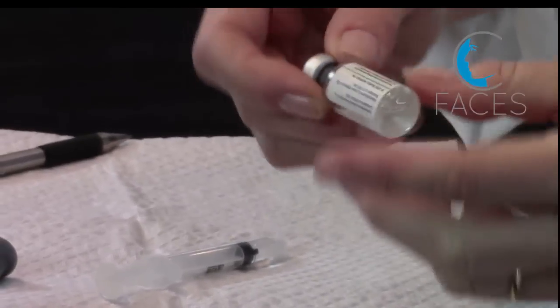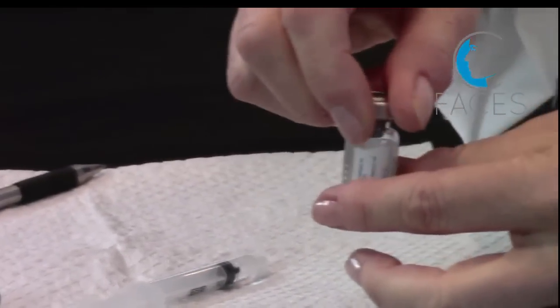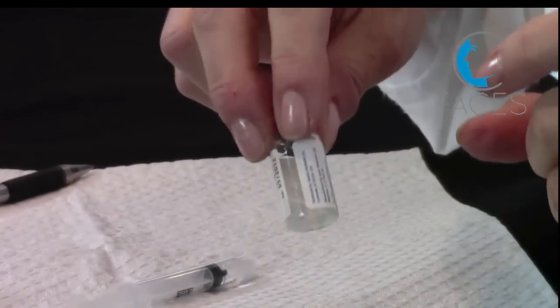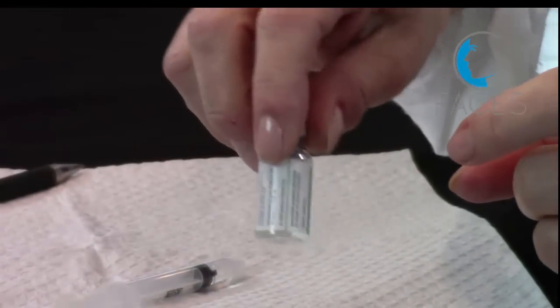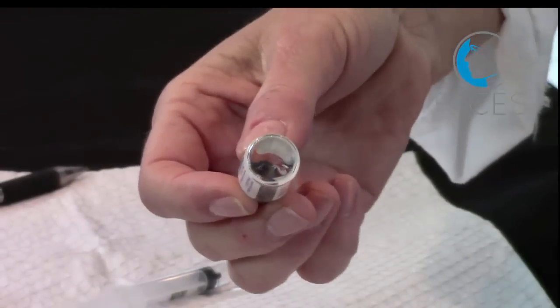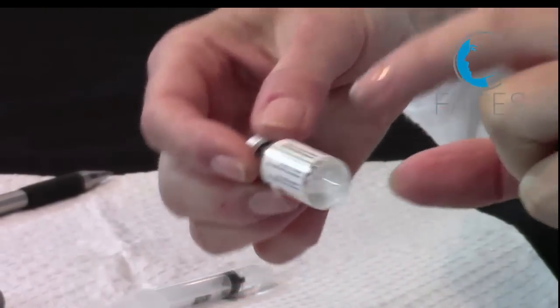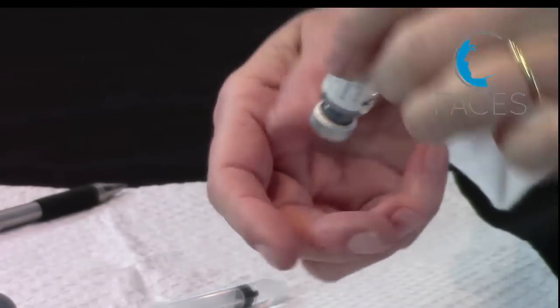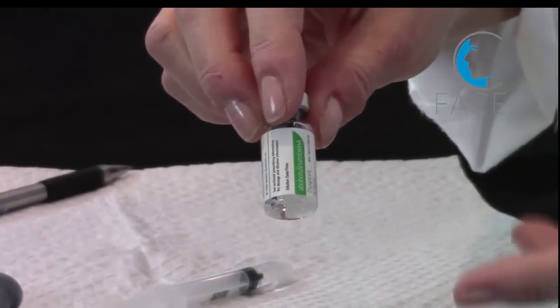Now simply rotate the vial to mix — there's no need for vigorous agitation, which would only create bubbles. With Xeomin, though, it's really important to be sure that you invert the vial when mixing. This is because the manufacturer uses a special lyophilization process, and the toxin often gets trapped up inside the stopper area. If you don't invert the vial, you may have incomplete reconstitution, which would decrease the effect per volume that you'd get.